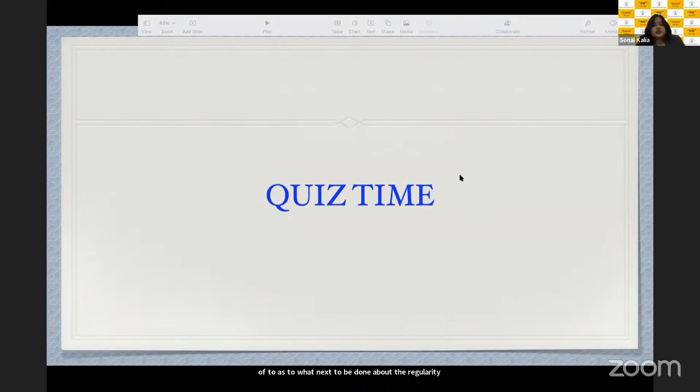The next question is, what is the difference between thinnest local and apex? Thinnest local will never be at the apex. Thinnest local is the thinnest part of the cornea in keratoconus. It will be below the apex because it is usually inferior thinning. So apex is the corneal apex, the geometrical center of the cornea. It is not the pupil center.